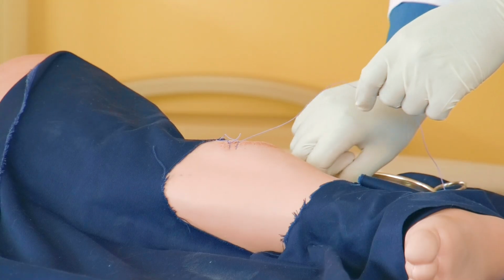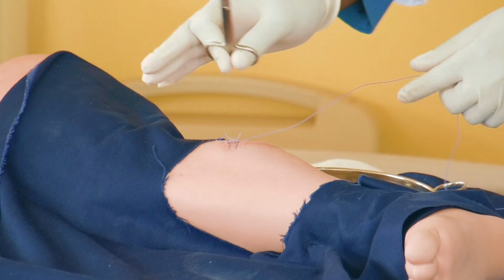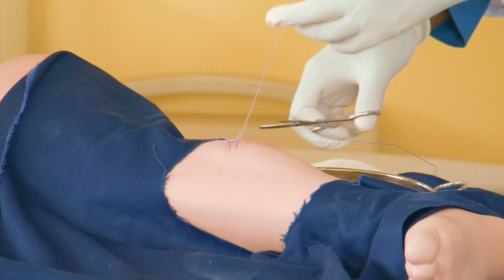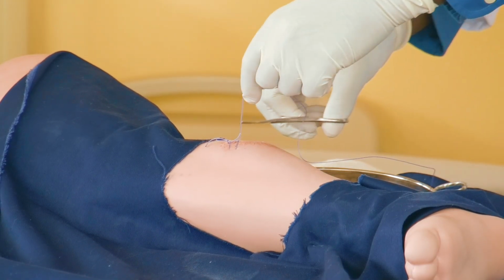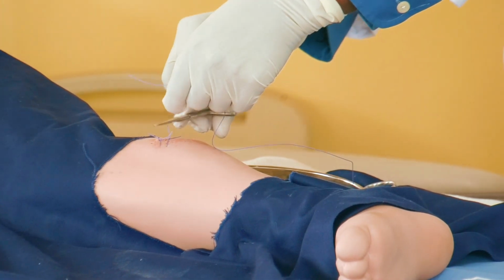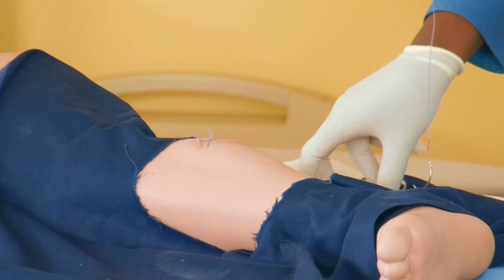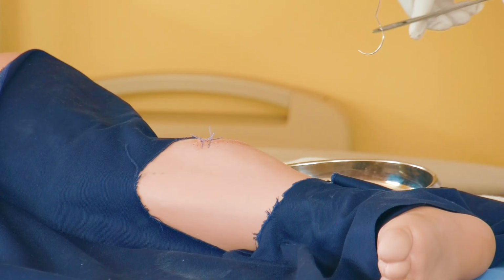So this is the beauty about this drape. It is sterile, you can work from here as well. Okay? So if we did not have Pastor Bruce around, I was going to ask someone to come and have a feel, do one.